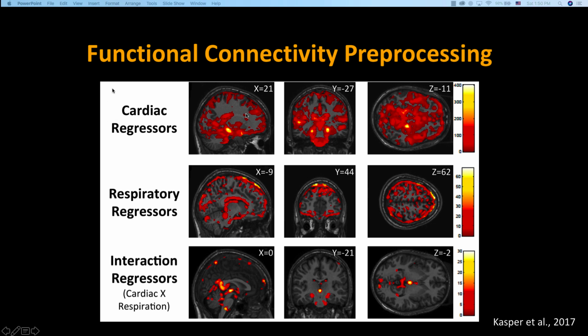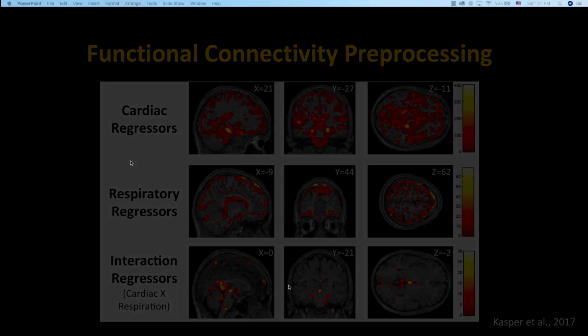So yeah, when you look at them, you should see basic patterns like this. Some people like to take the interaction. It's up to you. I'm kind of indifferent about it, but either way.